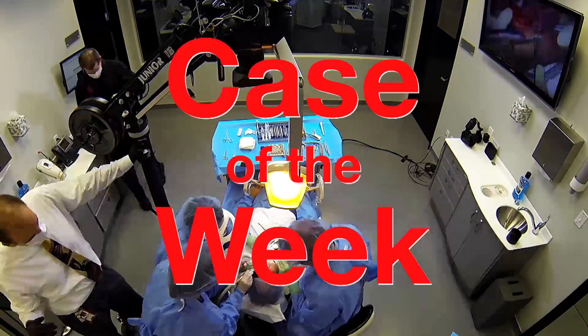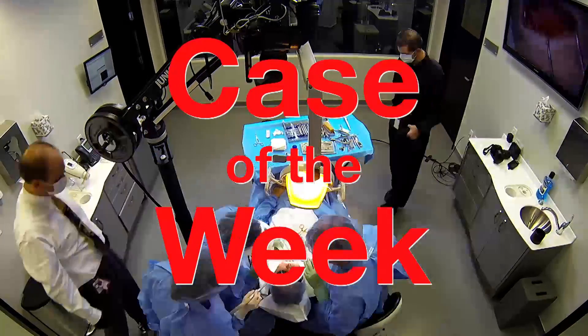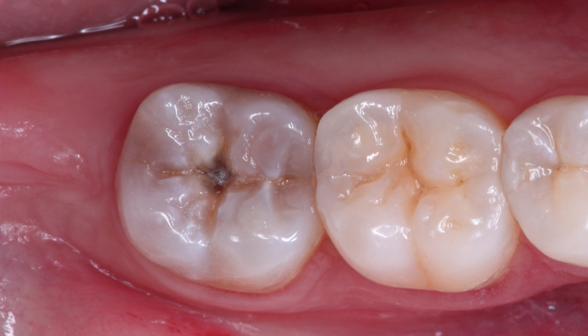Let's check out how it all comes together in this exciting restorative case. For this case, we have a patient with a chief complaint of thermal and pressure sensitivity in the lower right quadrant. Our examination reveals severe occlusal decay on tooth 31. The plan is to perform a caries cleanout and a direct camouflage composite restoration.